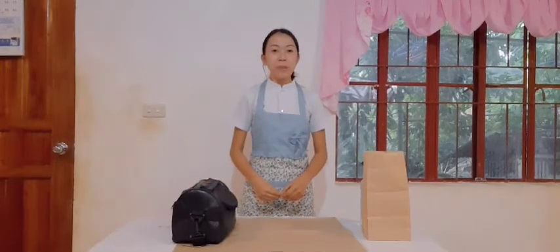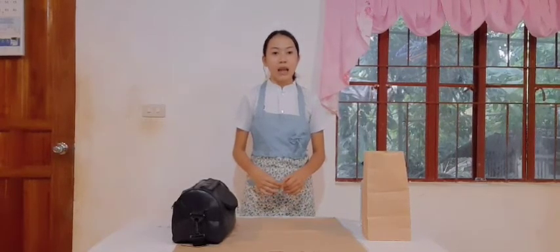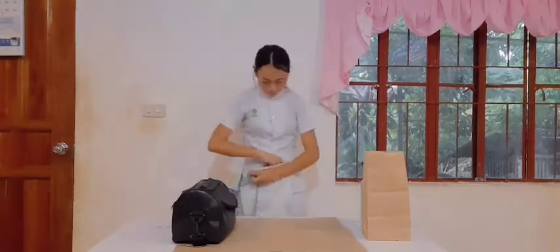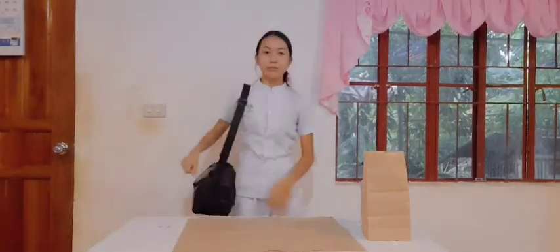I will now be removing my apron by observing the proper technique — do not let your hands touch the outside of the apron. Remove your apron by folding it away from you. Remember, the clean side must be out and the soiled side must be in. After that, put it inside your bag and close the bag.